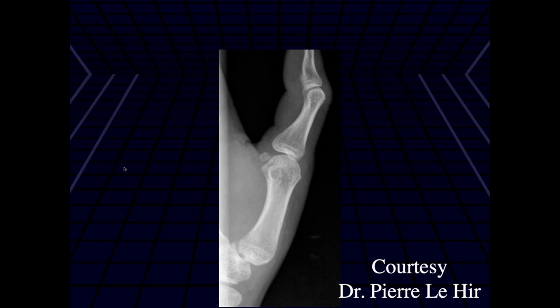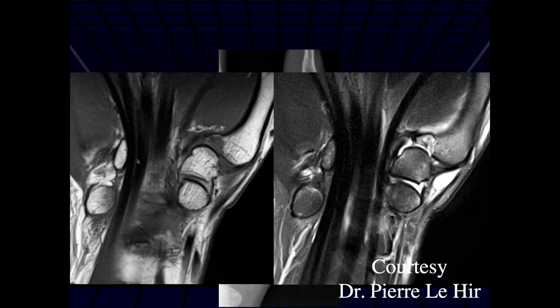We just have a single image of the thumb, but it looks like there may be some cortical irregularity along the ulnar aspect of the base of the thumb metacarpal. So I think this is a mildly displaced ossific avulsion injury fracture.